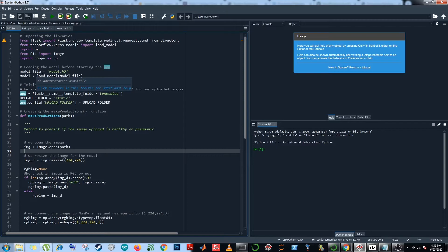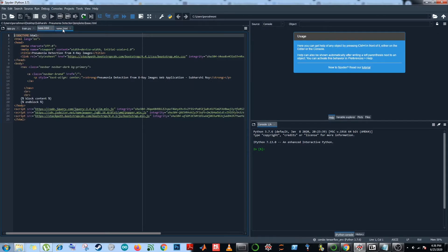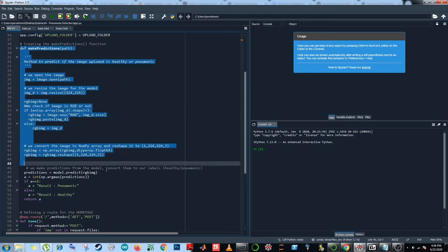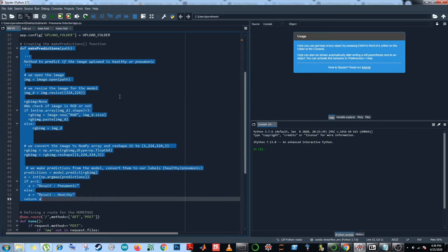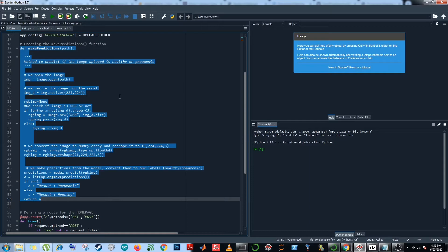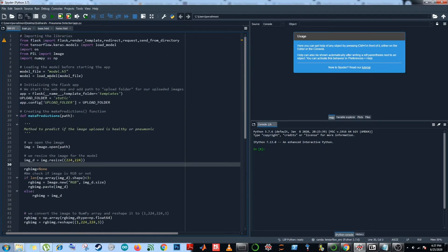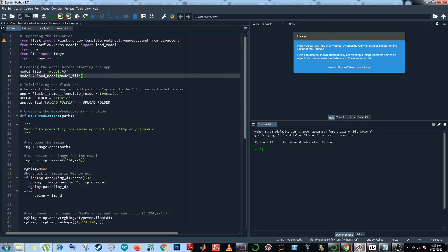If all other conditions are satisfied, then we save the file by removing previously uploaded files. There are two HTML files named as base.html and home.html, mainly for the frontend purpose. I will talk about this part of the code. We load the uploaded file from the path as we have mentioned and resize it to 224 by 224 and convert into RGB. If the image is in grayscale, since our model requires RGB files, we convert the image into a NumPy array and then reshape. Finally, we make predictions on our model, as the model which is mentioned over here. Convert them to our labels and return it. At our home method, we take this label and send this to our template.